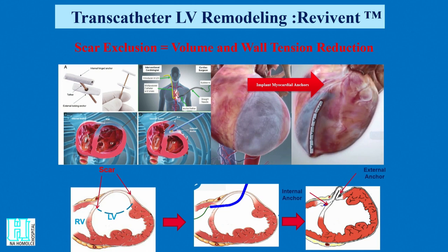So again, from the surgeon's side, the left ventricle is opened, just minimally invasive, through the left free wall through the septum to the jugular vein. And on this wire, you then apply the anchors. So then you can effectively lessen the aneurysm, exclude the aneurysm, okay? And in principle, you are going through what is visible here. So again, going through the left ventricle free wall, going through the septum to the right side.